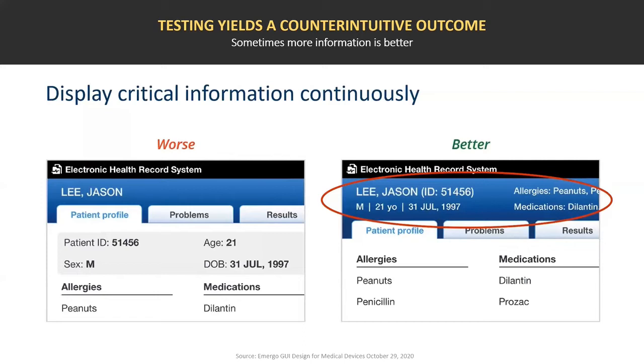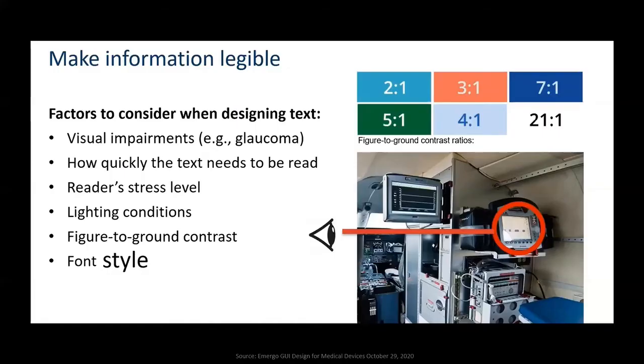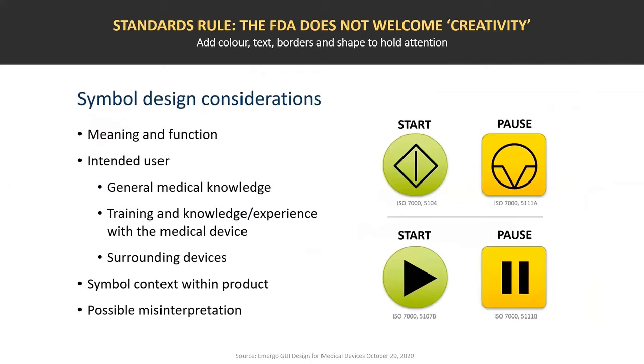Absolutely, yeah. And again, your point earlier about the assumptions that you make, you can certainly make assumptions at the beginning of a project, but you test and test and test till you're blue in the face, until you're absolutely sure that you've got a hardened system that is elegant and does what you want it to do, which is reduce the risk. And sometimes you get counterintuitive results. I mean, the previous slide about the skeuomorphic design, most consumer people making user interfaces would not use it.